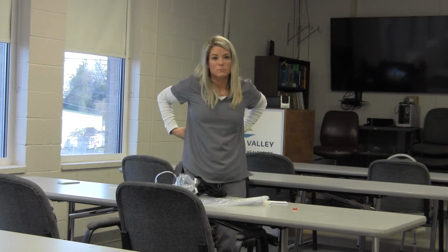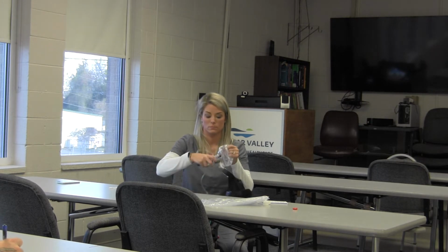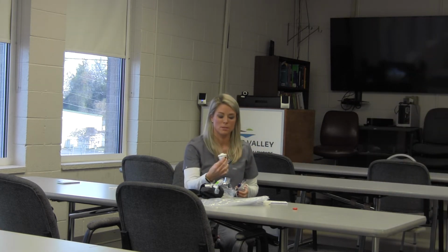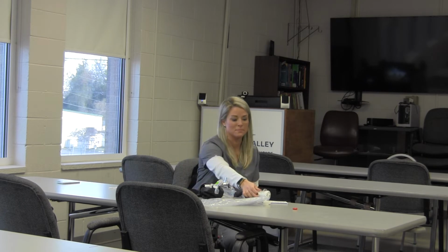Maybe you guys noticed there's this nice little cheat sheet sticker on here that tells you, for BiPAP or for CPAP, what your oxygen setting should theoretically be based on what you want your bilevel or CPAP settings to be. Ultimately, we should monitor the manometer, right? She said T, not elbow. So this would be how you set your stuff up to get what you would need. You have your sheets.